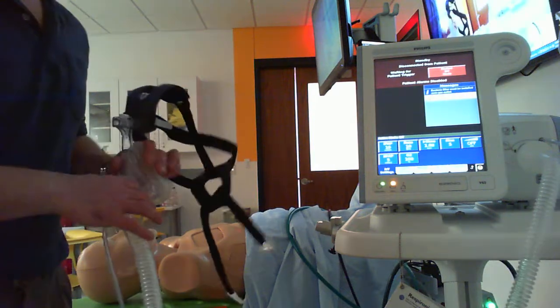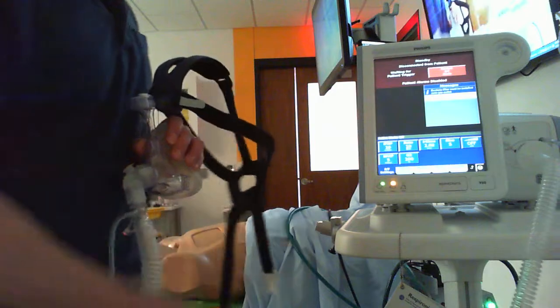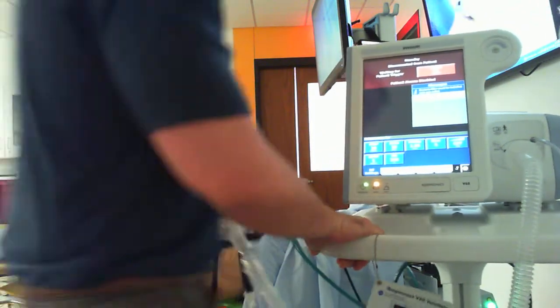All right, this patient would already be on their oxygen device, so I wouldn't take them off and then drag my feet and be slow and take away their support. Let's talk about initial settings here, and it's going to be a little bit tough. I'm going to try and bring this a little bit closer.